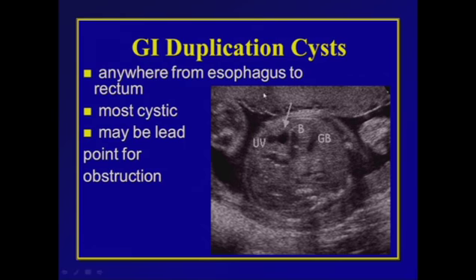And on this image here, I want to point out all the normal cystic things that you see in the upper abdomen of a fetus. So here's the gallbladder in the right upper quadrant. Here's a loop of bowel, presumably transverse colon. Here's the umbilical vein, which I know from turning color on and following its pathway. And here is a cyst that isn't supposed to be there.